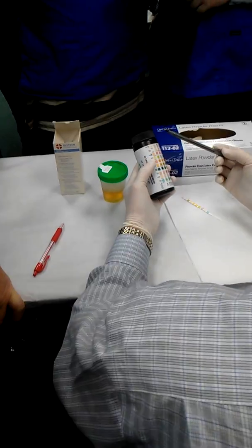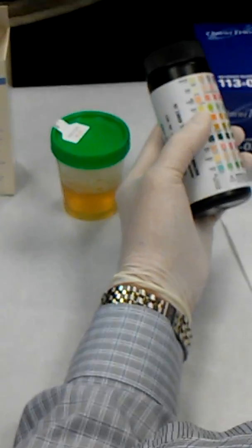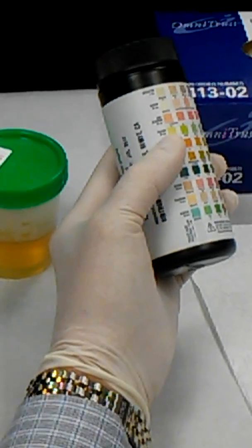So next is protein, like I told you. Protein should be negative in the urine. If protein is positive, it's a kidney disease. You see, kidney disease. Okay?